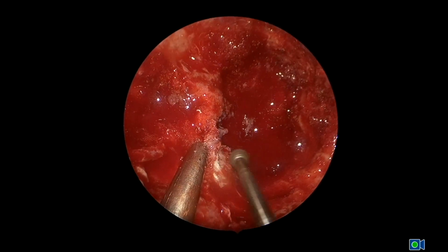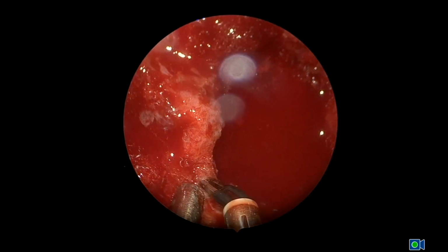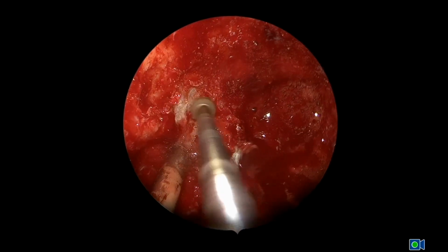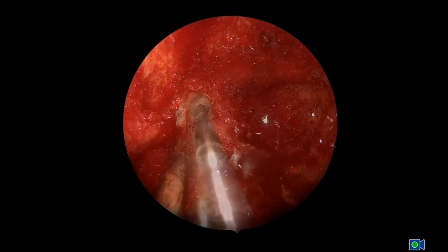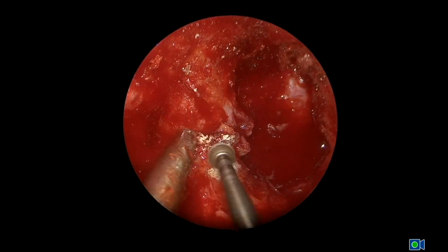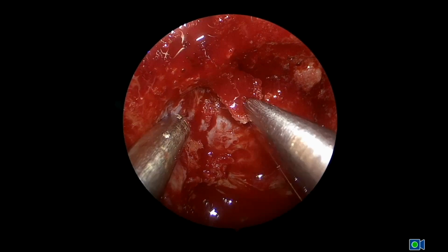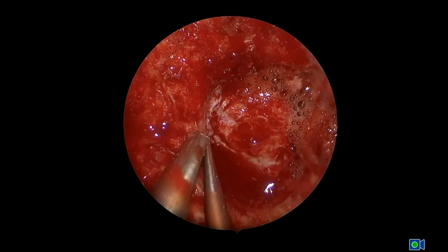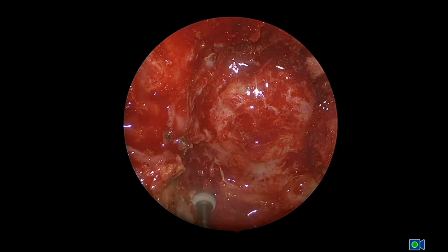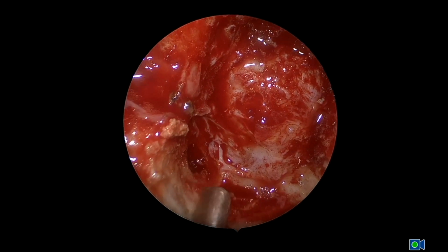And then we keep removing this abnormal tumor to expose all the way to normal dura. Again, the area on the paraclival and foramen lacerum, again arterial bleeding that we control easily. We can see V2 prominence with another bleeder around V2. This is exposing again the anterior wall of the cavernous sinus and paraclival corridor on the right side. Dura of the middle cranial fossa is also being exposed. And now we drill towards the petrous apex and jugular tubercle on this patient's right side.